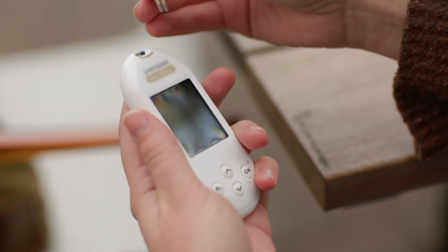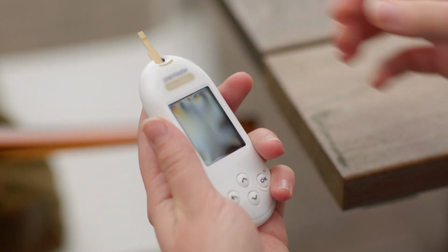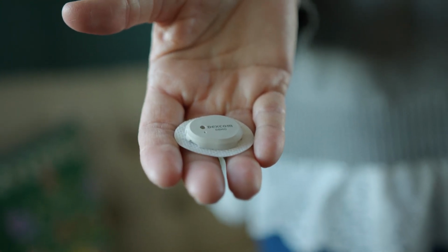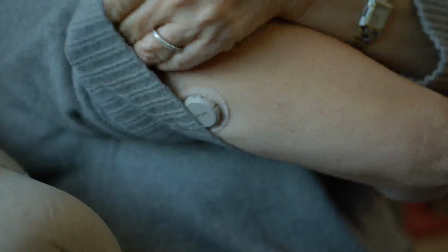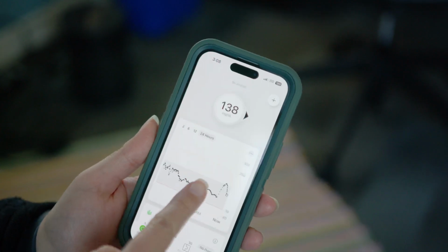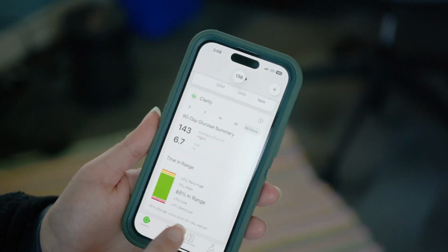You can measure your glucoses with a glucometer where you do finger sticks every day, and that's been the gold standard of measuring glucoses pretty much forever. It's the most accurate way to get a sense of what your body's glucoses are doing, but now, more often than not, we are also offering people continuous glucose monitoring, and that comes in the form of a Dexcom or a Freestyle-like monitor, and these monitors you can wear on your arm for 10 to 14 days at a time. They will measure your glucose every minute or two and either send them directly to your reading device or your phone, or you can scan them with your reading device or your phone.